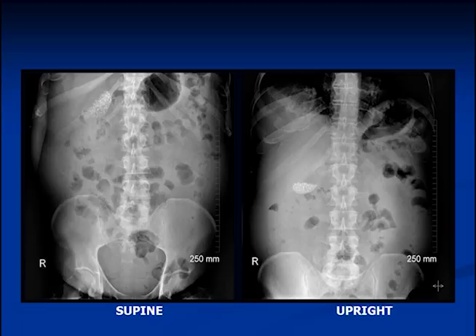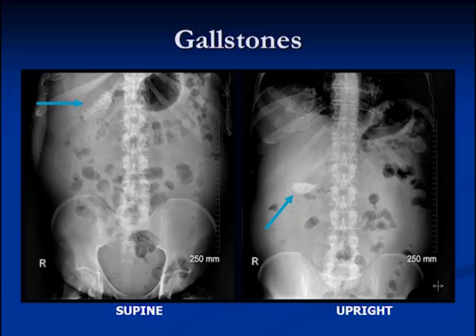There's some calcification in the right upper quadrant on this film — these are gallstones. If we do an upright view, you can see that the stones layer out — they're a little heavier than the bile, so the bile is on top and the stones are on the bottom, and you get what looks like an air-fluid level.